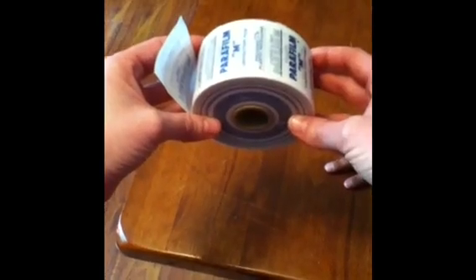We get a roll like this. I order one about once every 18 months or so and it will last me — and I use it every day. We just cut off strips the size that we need. We get it on the internet for about $15, so it's inexpensive considering how long it lasts.